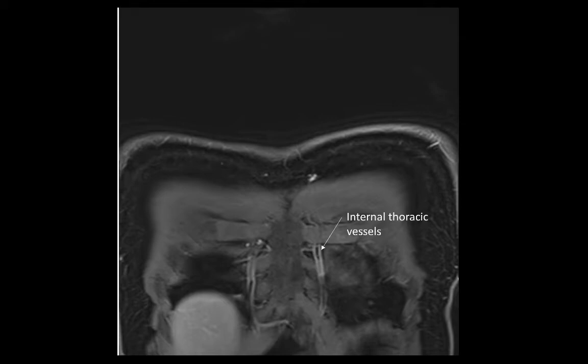Here we can see the internal thoracic vessels lateral to the sternum, and we can also see the costal cartilages and the liver.